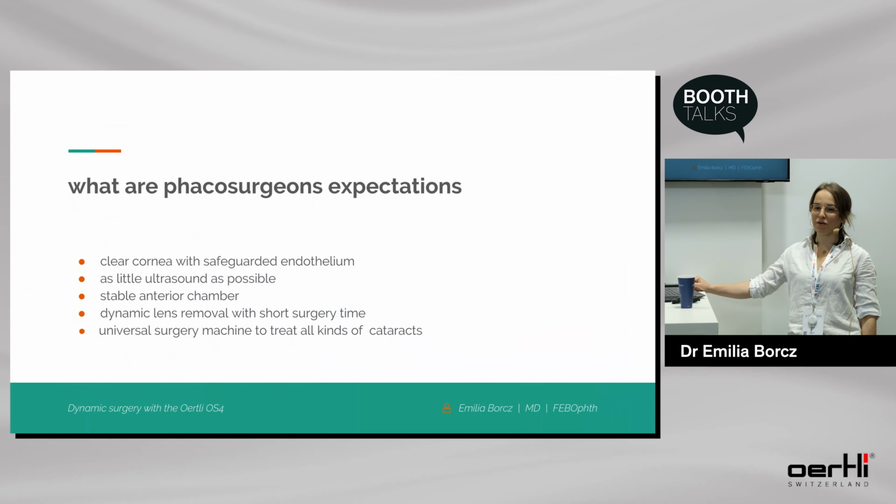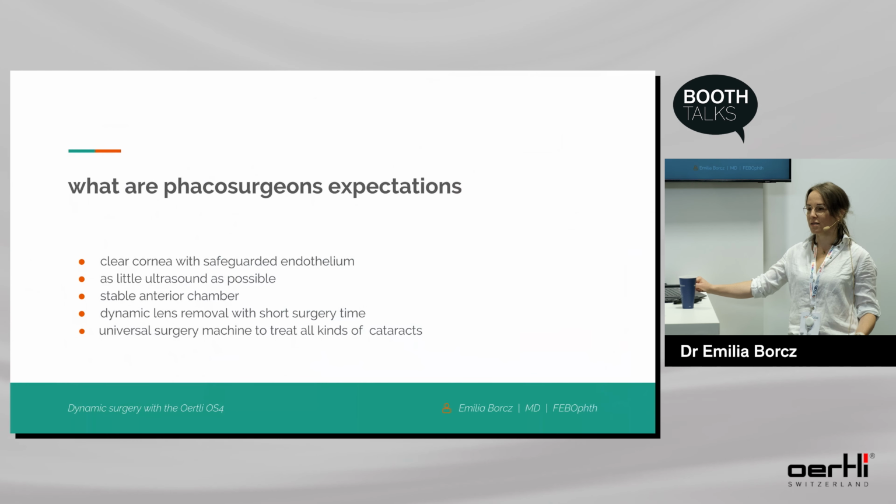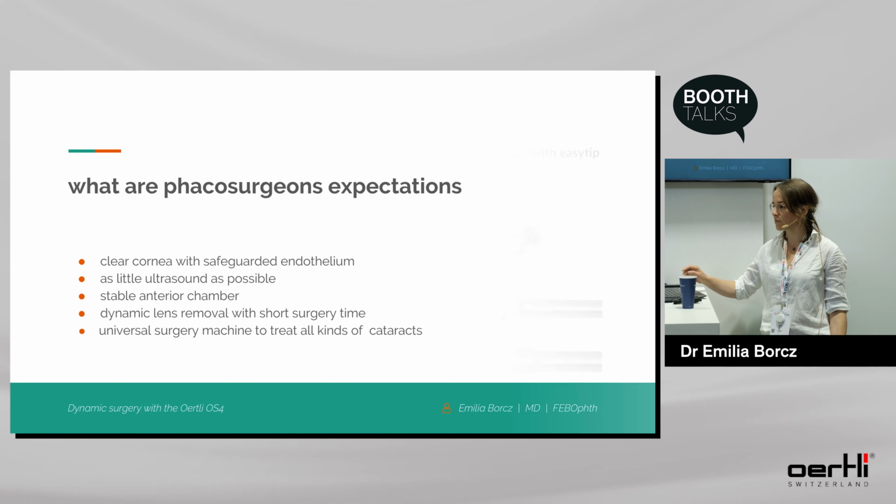For sure they are very high. We all would like to have clear cornea with safeguarded endothelium, using as little ultrasound as possible. We would like to have stable anterior chamber, and we would like to remove the lens dynamically with short surgery time. And we would like to have a universal machine to remove the lens, all types of lenses.